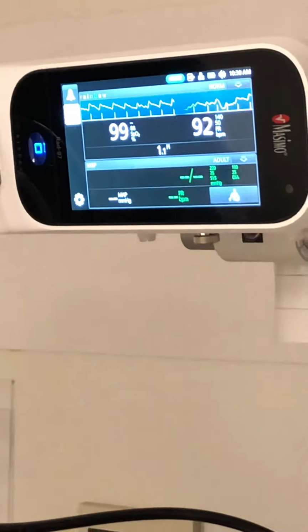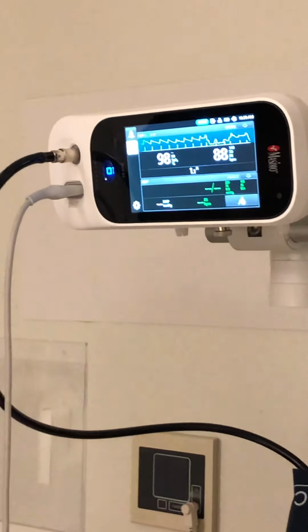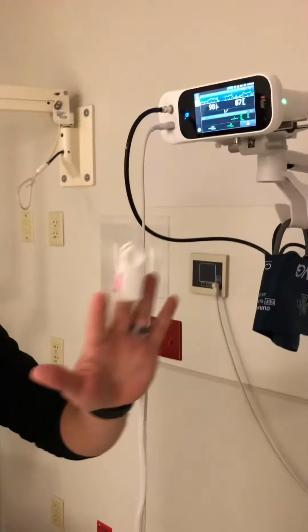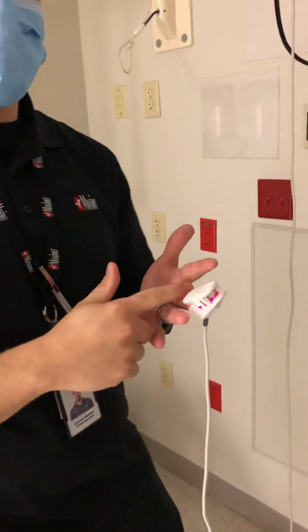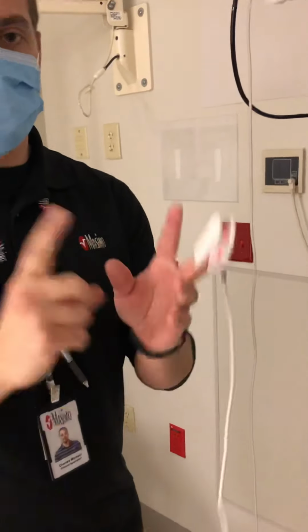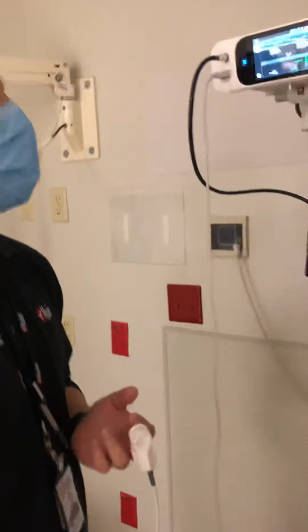But just to go over the basic functionality of the device, you guys are familiar with the SpO2 pleth waveform. I've got my finger sensor on here. From an application perspective, we generally recommend either the ring or middle finger of the non-dominant hand. Obvious reasons, it's just more intrusive to the patient if it's on the index finger as they eat and drink throughout the course of the day, so on and so forth, okay?